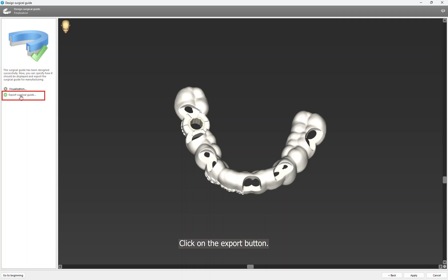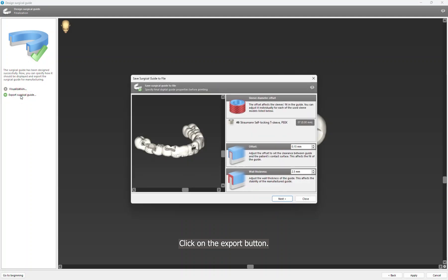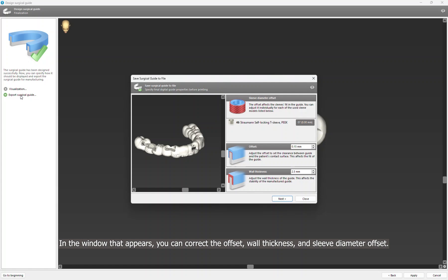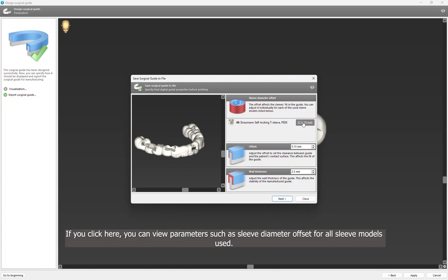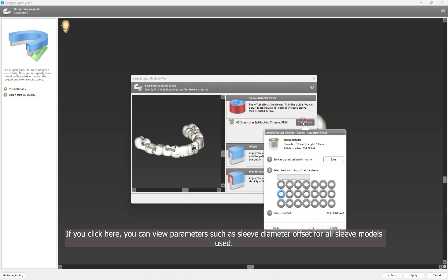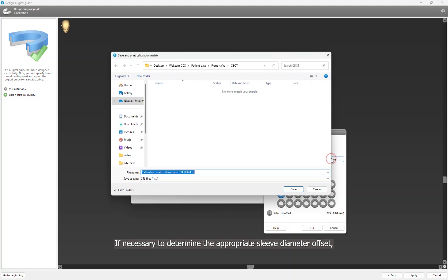Click on the Export button. In the window that appears, you can correct offset, wall thickness, and sleeve diameter offset. If you click here, you can view parameters such as sleeve diameter offset for all sleeve models used. If necessary, to determine the appropriate sleeve diameter offset, you can export a so-called calibration matrix.